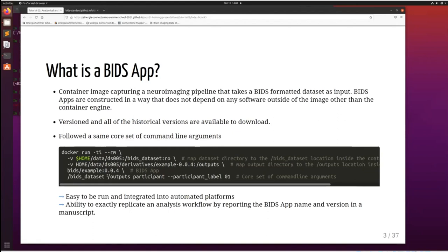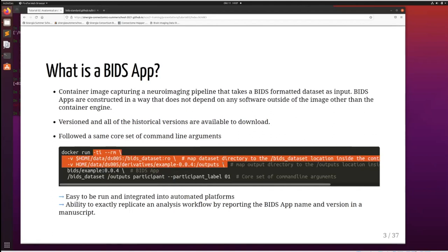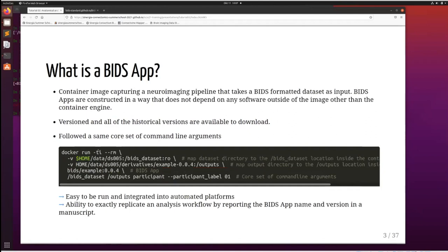Each BIDS app should follow the same core set of command lines: providing the BIDS root directory, the output directory, the level of analysis, and then the labels of the different subjects or participants to be processed. If you don't provide any labels it just processes the entire dataset. All the tags before the core set are more related to the container image itself — for example, running in interactive mode or removing extra data.